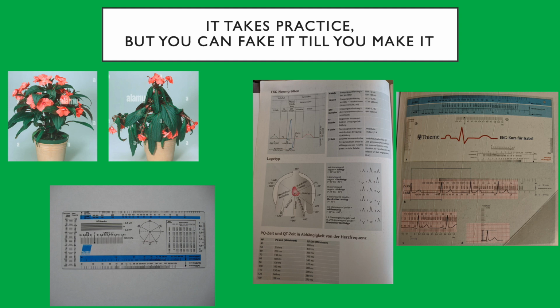So you are allowed to have some cheat sheets, like the one I gave you. So you can have the information. You don't have to memorize it. You can use it. No one is examining you. It's not an exam, right? You can buy rulers on Amazon that you can use to estimate the heart rate and stuff. So you can basically cheat your way until you finally understand what bradycardia and tachycardia are, just by looking at it. But in the beginning, you can use a cheat sheet. You always have the ruler in your scrubs. You take it out, so it's much faster.